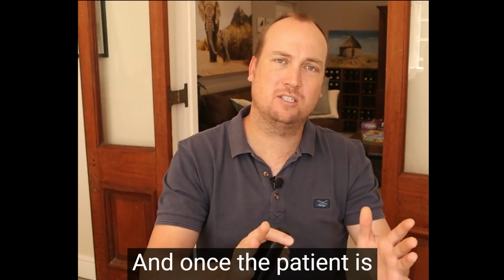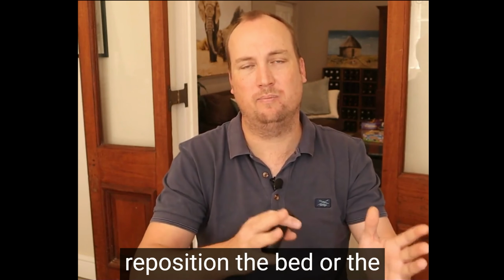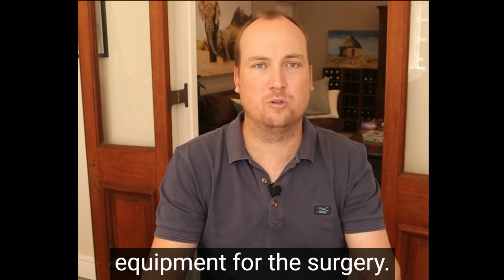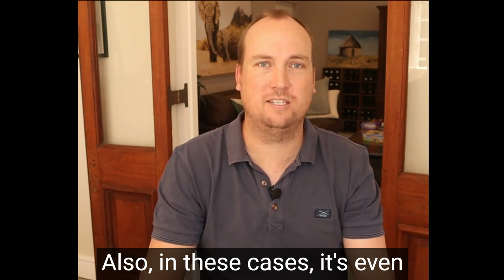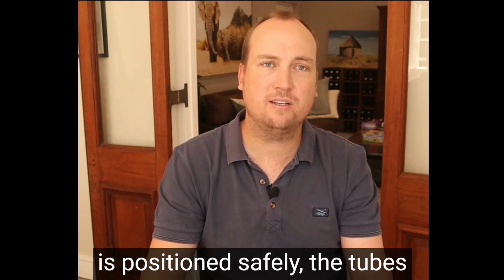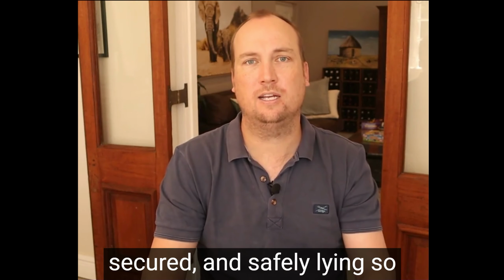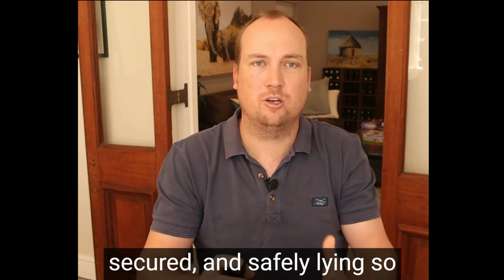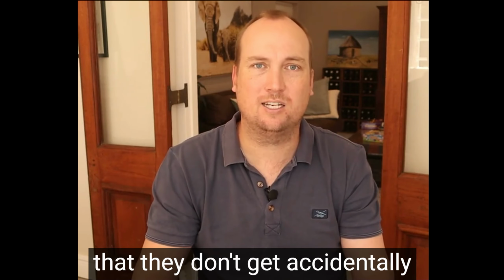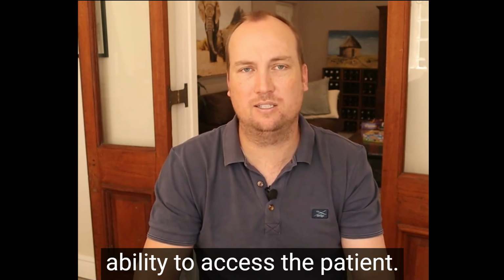And once the patient is safely asleep, then I can reposition the bed or the equipment for the surgery. Also, in these cases, it's even more important that the patient is positioned safely, the tubes and pipes and monitors are all secured and safely lying so that they don't get accidentally pulled out or disconnected, and they're not impeding my ability to access the patient.